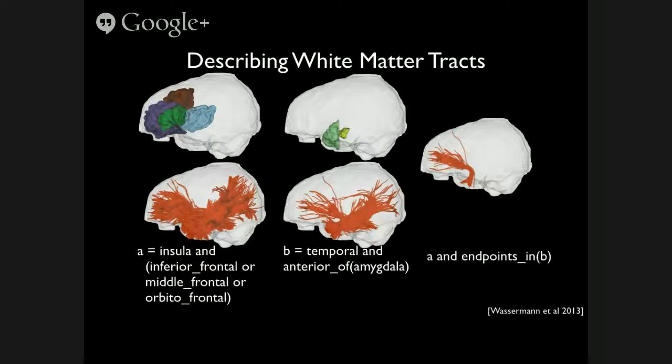So you have your T1 and your diffusion at the beginning. How do you make sure they're in the same space? You can use Slicer, or you can use any tool. Usually, our data process is we register the T1 to the diffusion weighted image, to the B0, and we have processed the FreeSurfer parcellation on the T1.